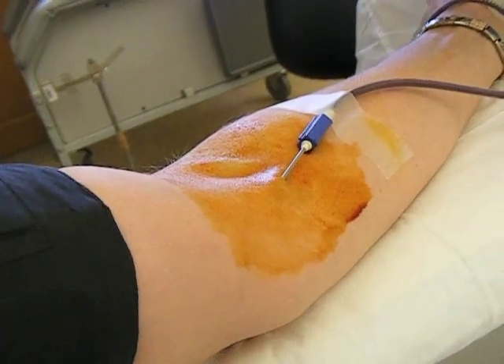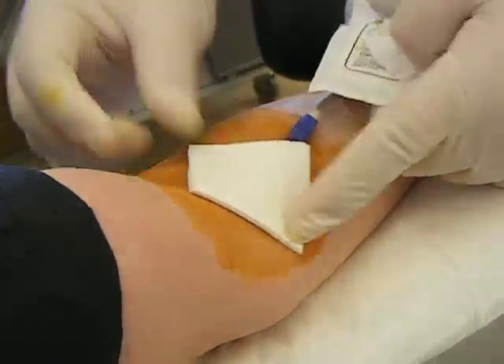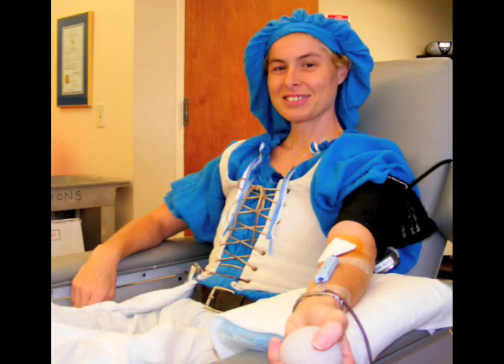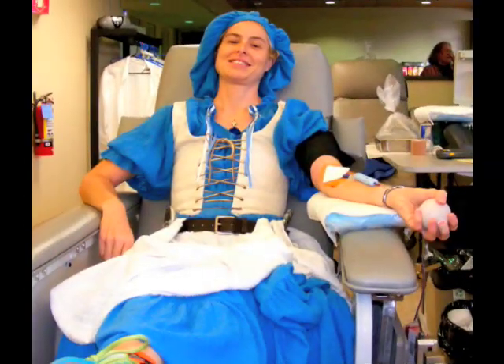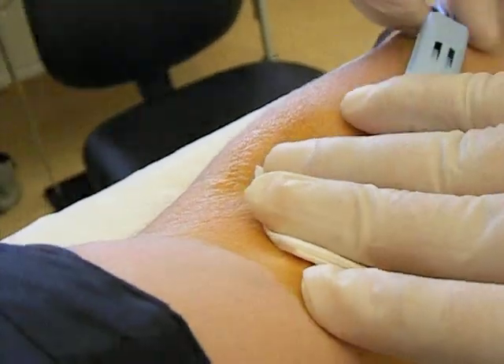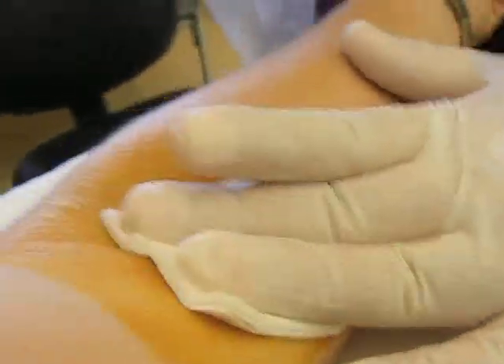Okay, so you can roll the ball around in your hands or just give it a gentle squeeze every five to ten seconds. Okay, I'm going to press there.